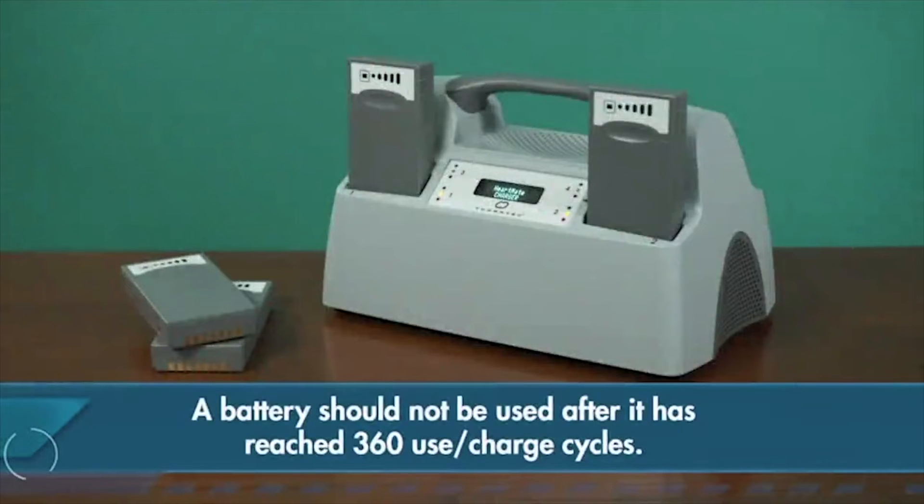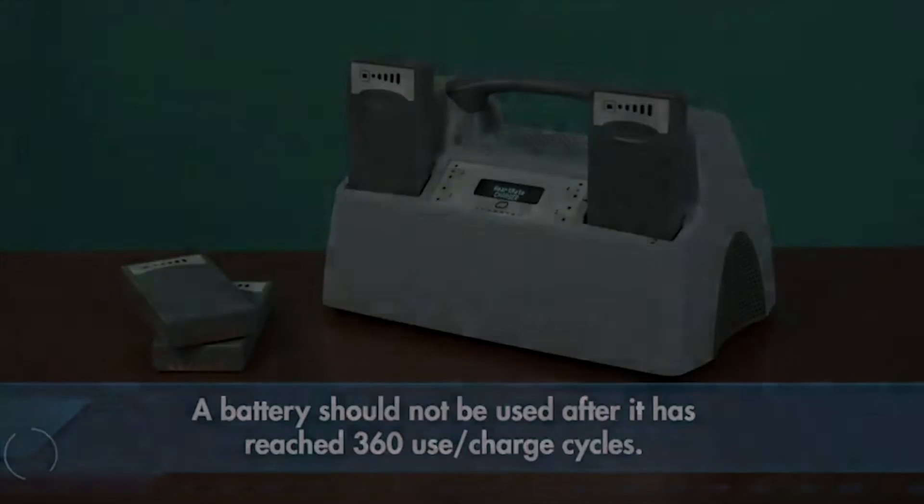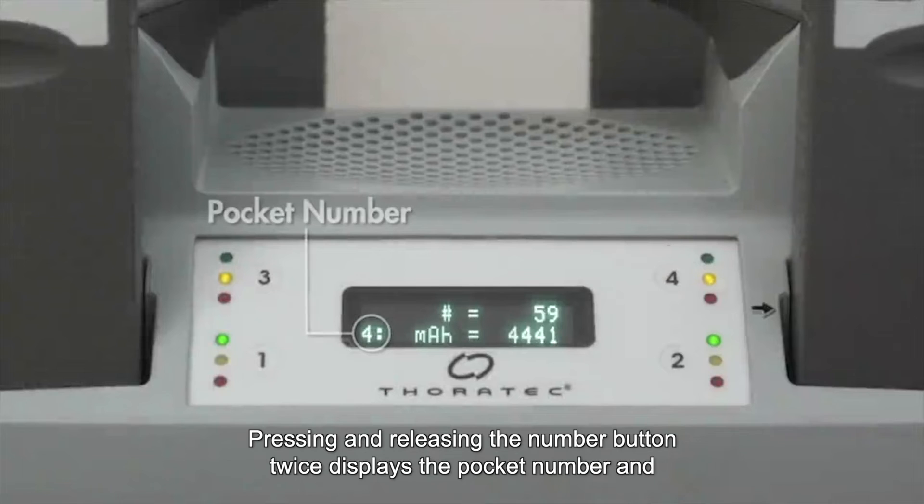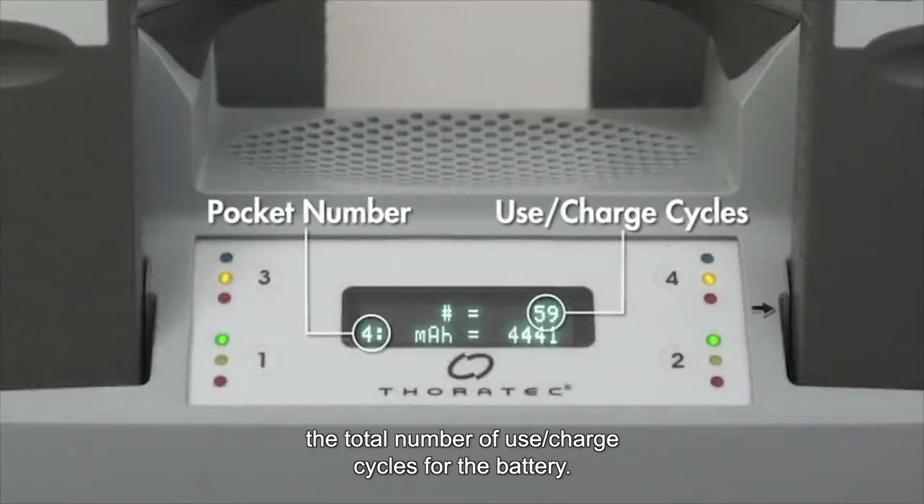A battery should not be used after it has reached 360 use charge cycles. Pressing and releasing the number button twice displays the pocket number and the total number of use charge cycles for the battery.